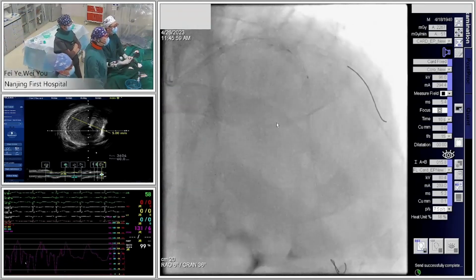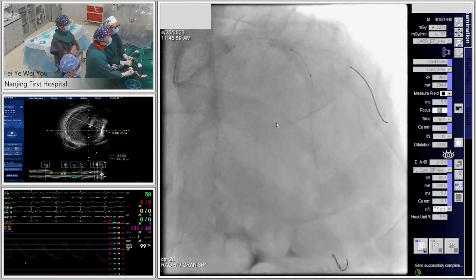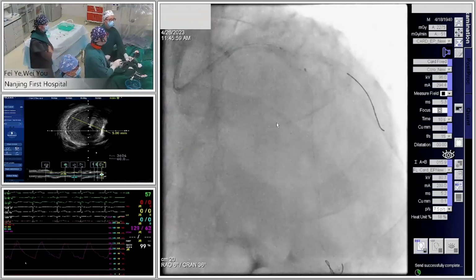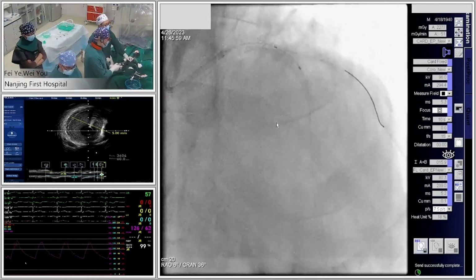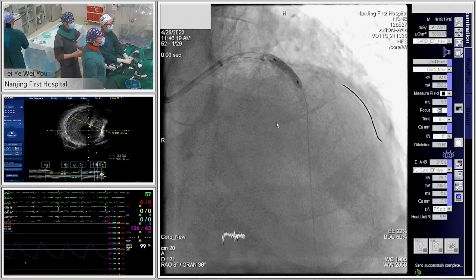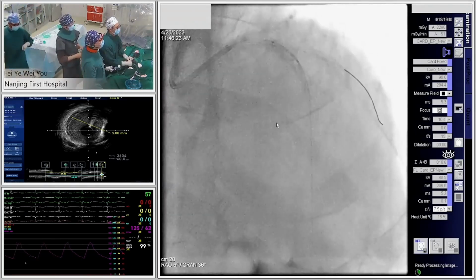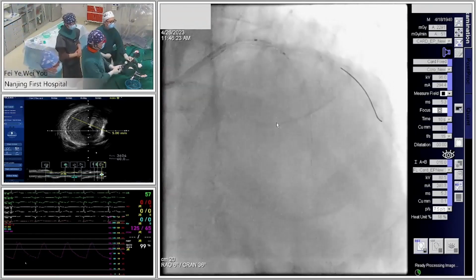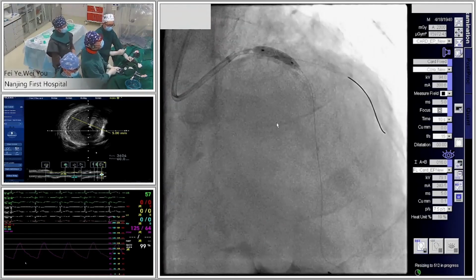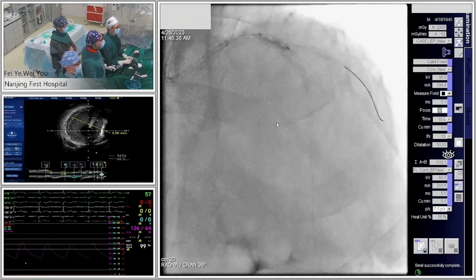Sometimes, so I have a question here: do we leave the wire there? Just because the proximal length was a lot longer. If we meet this kind of phenomenon, where the proximal part of the LAD is very long with a very long lesion or a very calcified lesion, and we perform very high pressure post-dilation at the proximal part of the LAD, we cannot pull back the side branch wire, I mean the jailed wire, very smoothly. Sometimes we use the angle tactic.